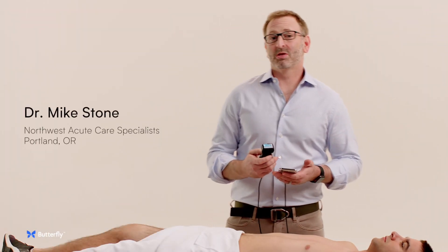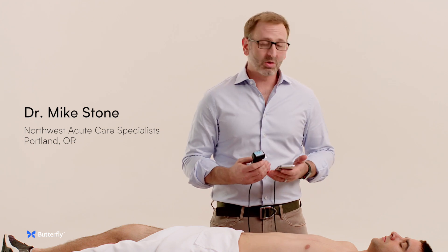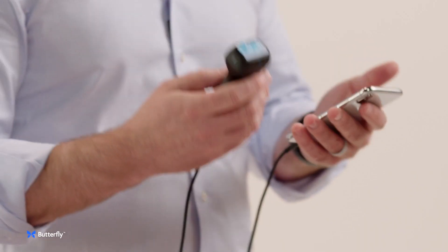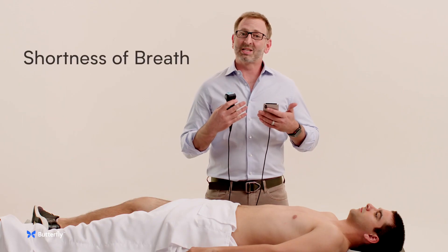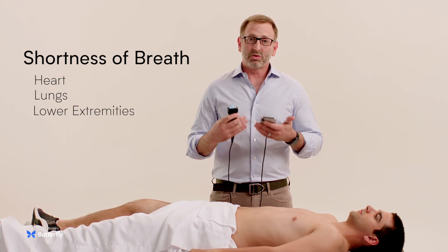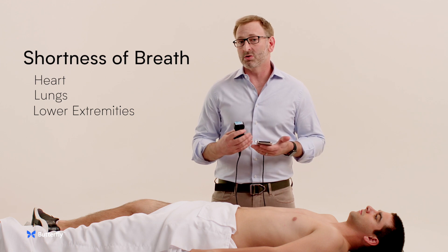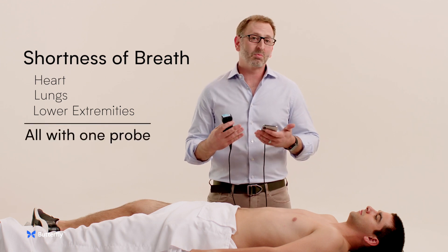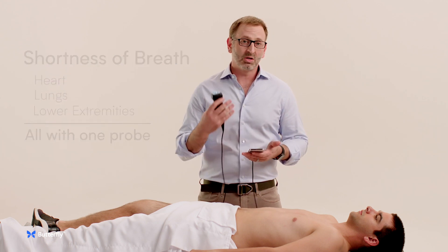I'm Mike Stone, an emergency physician and point-of-care ultrasound specialist. I'm going to show you how to assess a patient with shortness of breath or dyspnea using the IQ. Typically, assessing a short-of-breath patient with ultrasound includes the heart, the lungs, and potentially the lower extremity veins. With a traditional ultrasound system that involves switching two or three different transducers, we'll show how quickly and easily you can assess all three using just the IQ.